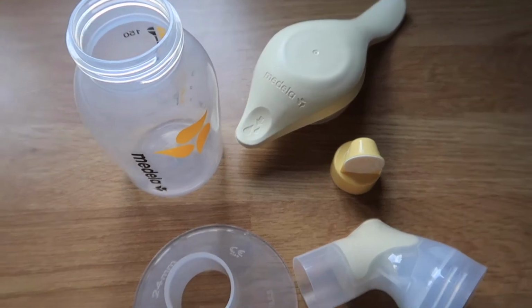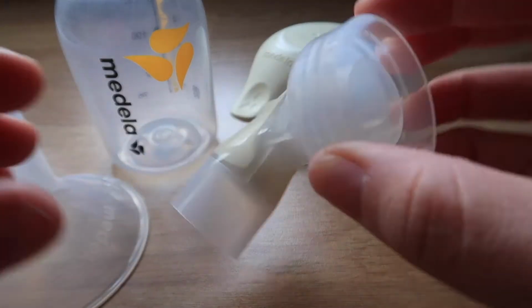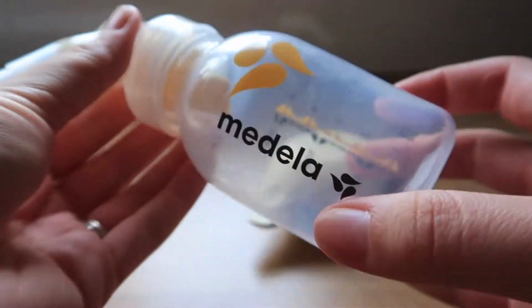And for me, because I wasn't exclusively pumping, I just found the manual one so much more convenient, because here it is. I mean, there are literally, I think, about 4 or 5 parts to this, and it's so easy to put together. Obviously you've got this bit, and your breast and your nipple go into the center of that, and then this bit comes off and it just pops into your sterilizer. And yeah, I think there's 5 components to it, and it's really quick and simple to put together.